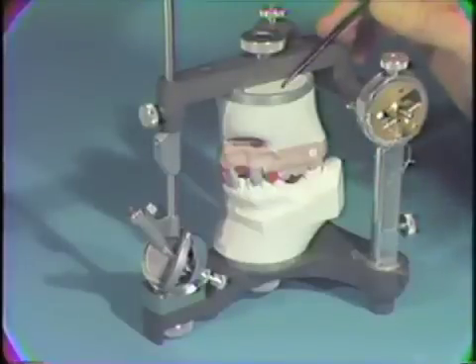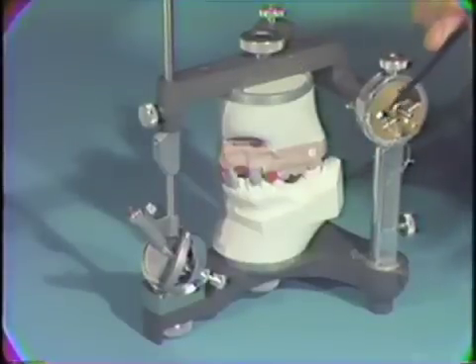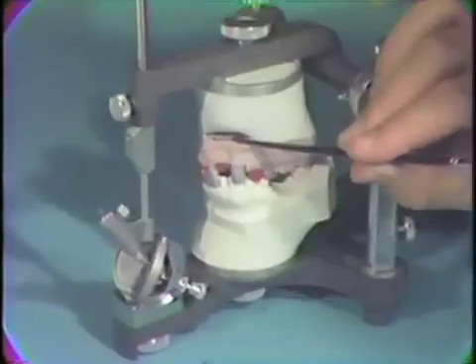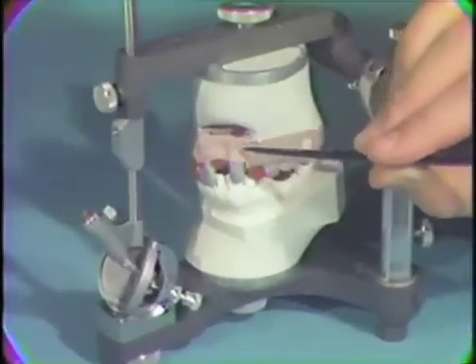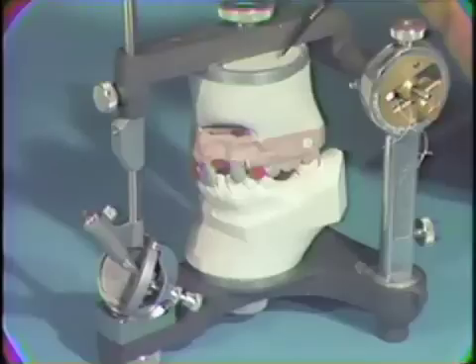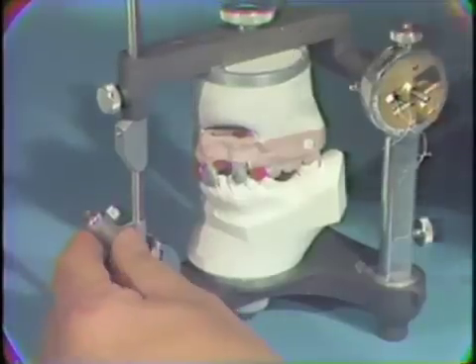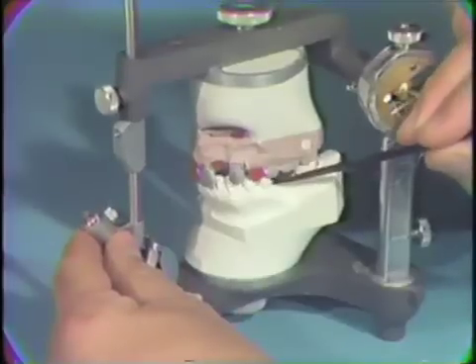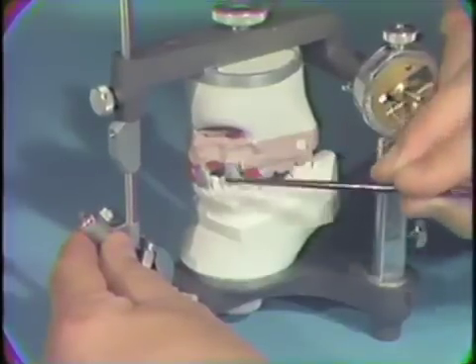The case is articulated with shims in the condyles. The occlusion should be double-checked to make sure it is correct. You will note the void in the anterior part of this pour-up to allow access to the removable dies. The pins have been removed and the occlusion is checked. If everything is correct, then wax patterns will be made on our removable dies.